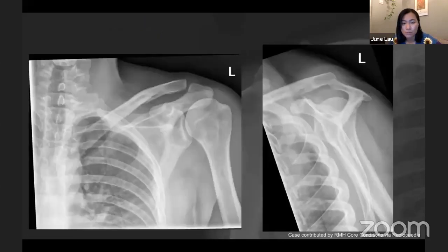Let's see how many more we have. I think this might be one of the last ones. So I'm just going to start by telling you that A and B are okay. So why don't you focus on the latter bit of your assessment?